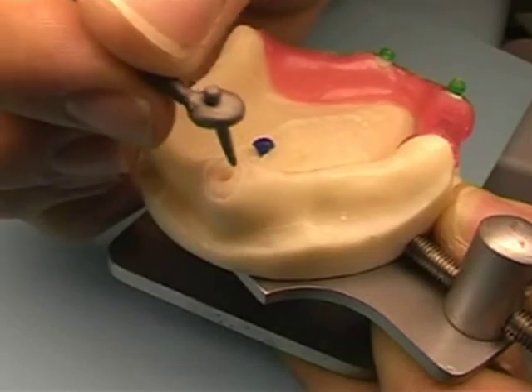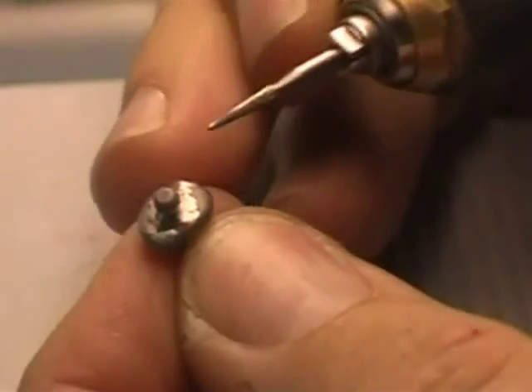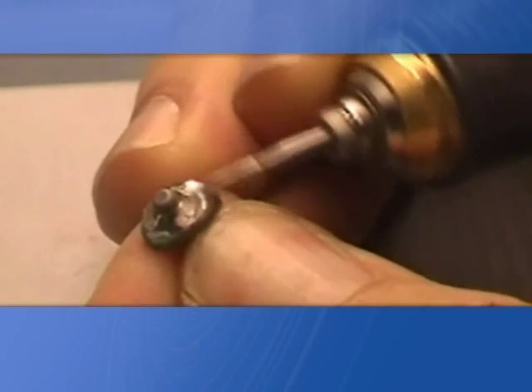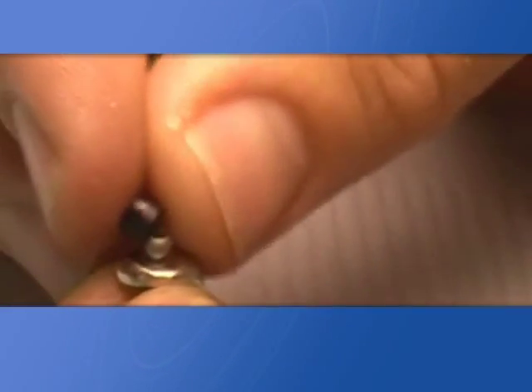Working closely to the naked sphere, always be very careful not to polish it or wear it out, especially around its equator. To avoid these inconveniences, always protect the sphere, snapping a black processing cap over it.